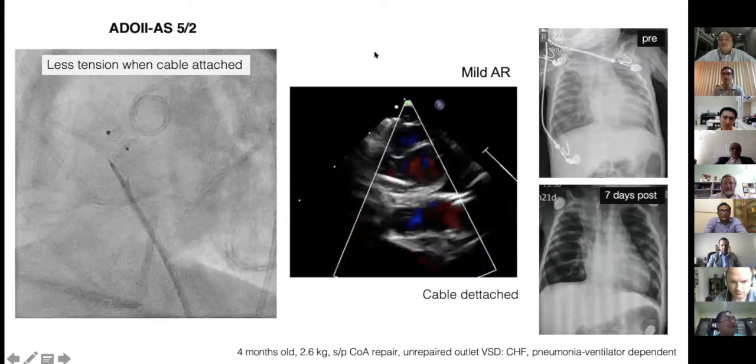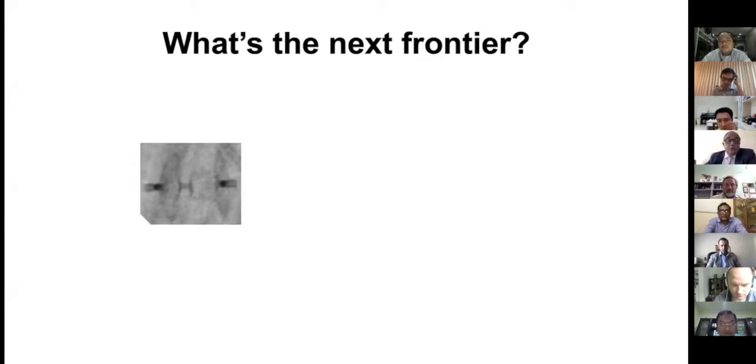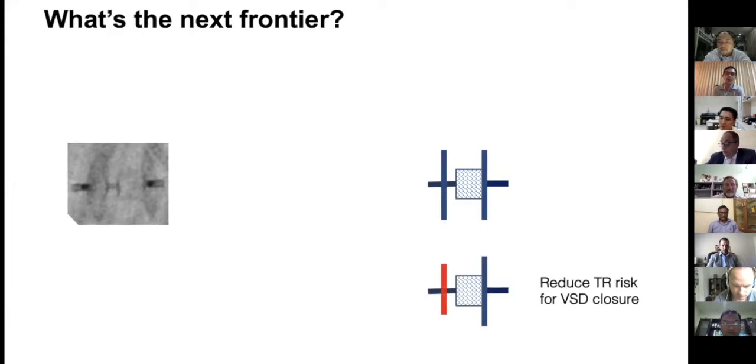And this is a chest X-ray before and after the procedure. Right. So just to emphasize again, when we discuss the MFO or the Konar-MF, it means that this device is a double disc design with the body in the middle like this, with the hub on both sides, and it means that we use this in very multi-purpose indications. But again, we can have some improvement or some adaptation adjustment for this device.